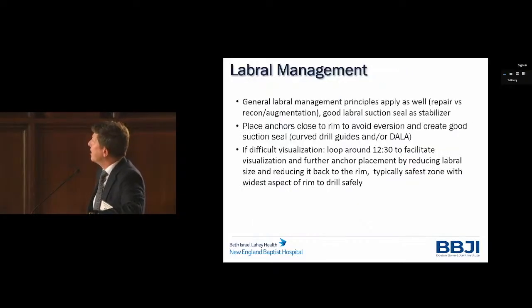For labral management, the general principles of labral management in any hip arthroscopy apply here as well: repair versus reconstruction, augmentation. You want to have a good labral suction seal because the seal also functions as a stabilizer. Place the anchors close to the rim to avoid eversion of the labrum. Create a good suction seal. Use curved drill guides and or DALA as needed.